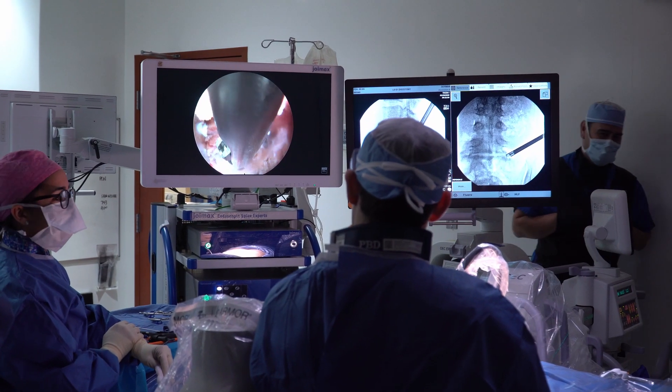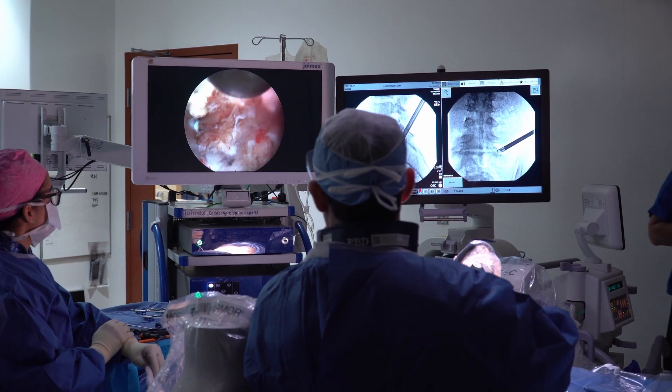From the young patient with a soft disc herniation to the older patient with arthritis and more chronic issues, both of these things are able to be addressed with endoscopic techniques.